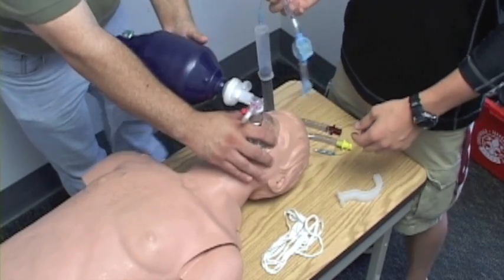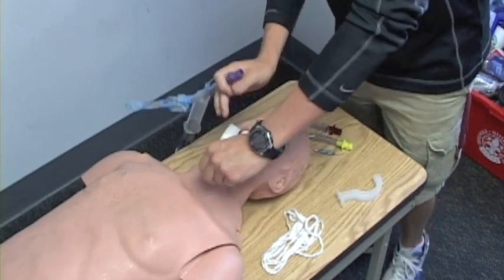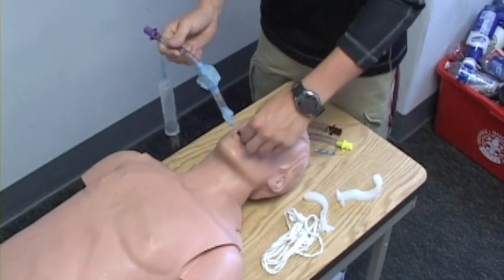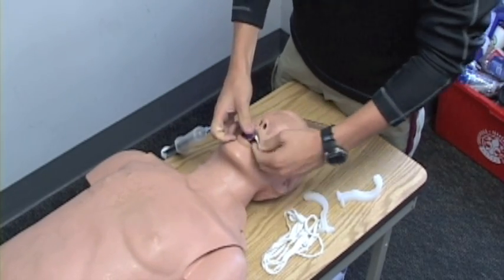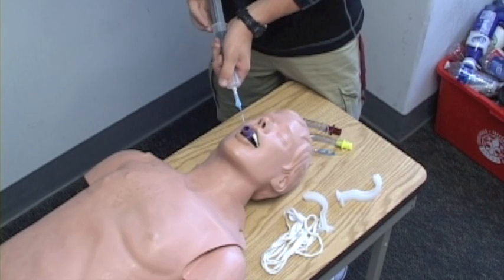I'm going to go ahead and remove the oral airway. I'm going to lube up my King and insert it at a 45-degree angle, then rotate to 90 degrees. Halfway in, I'm going to rotate it down to the teeth mark, then inflate to the proper amount.